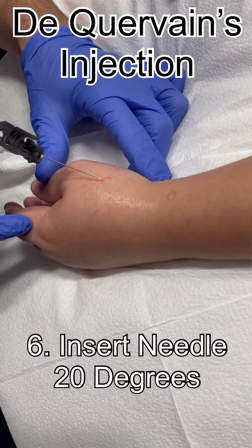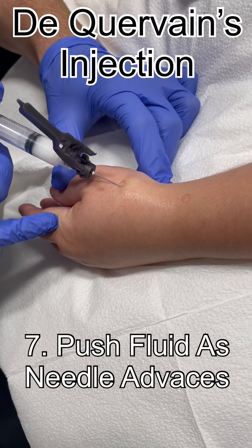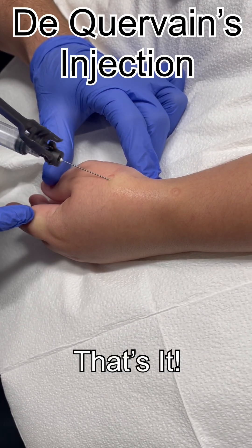Prep. So big deep breath — little poke, little pinch and pressure. You okay? See that area puff up — and beautiful. And that's it.